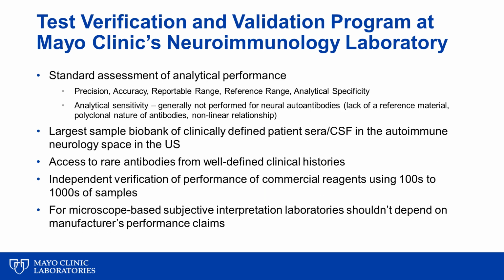Given the mentioned limitations of neural antibody testing, in the neuroimmunology laboratory at Mayo Clinic, not only do we evaluate standard analytical performance characteristics such as precision, accuracy, reportable range, reference range, and analytical specificity, but we also incorporate a rigorous evaluation of diverse samples and ensure a high degree of interpretive competency is present in our staff before performing clinical testing.